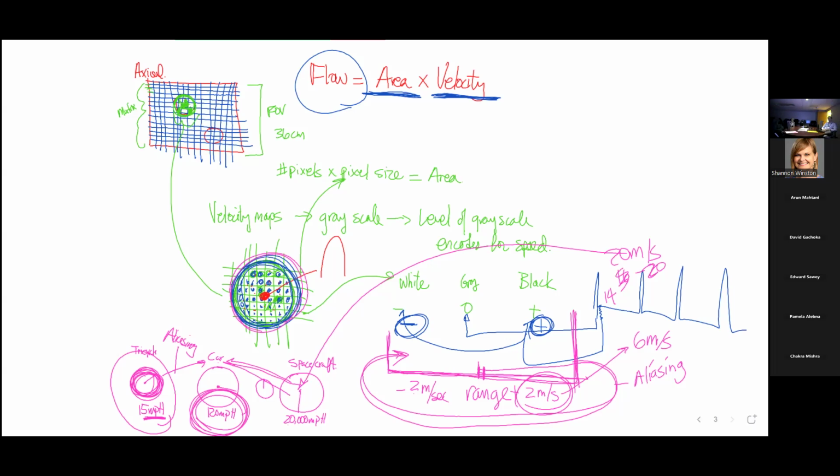Okay? So, what were some of the things we have to think about when we're measuring blood flow? One is we got to now deal with our respiratory motion. We got to plan for that. Number two, we've got to be thinking about our temporal resolution is going to be cut, right? Because instead of one phase encode, we have two, right?